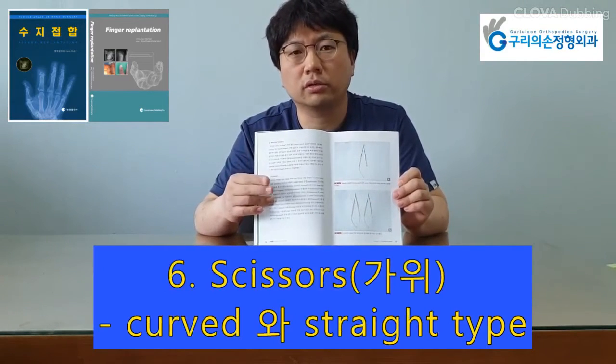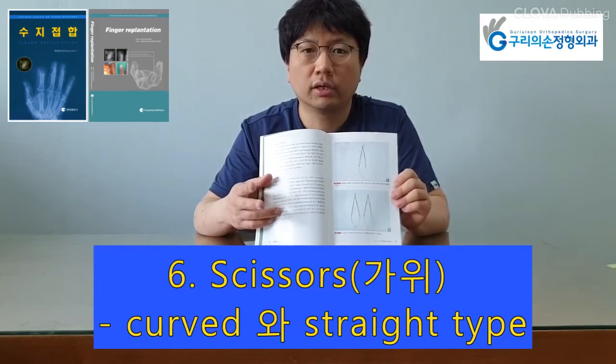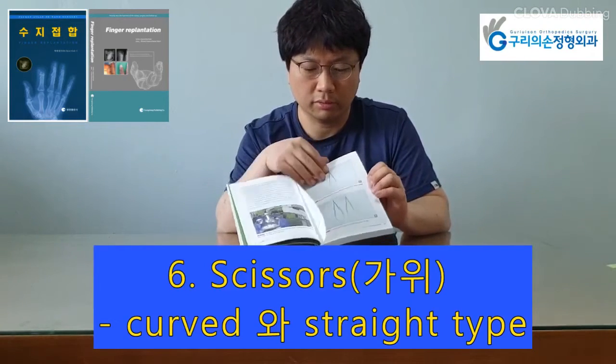Scissors could be curved or straight, blunt or sharp-tipped. Curved type is more convenient to dissect the neurovascular structure, and straight type is for trimming of the vessel.